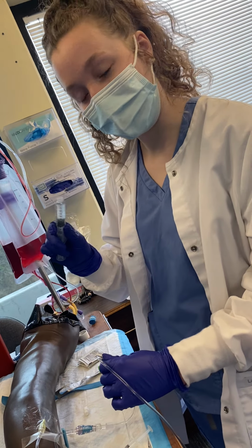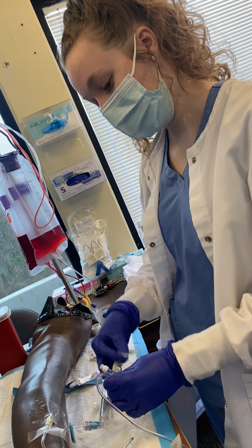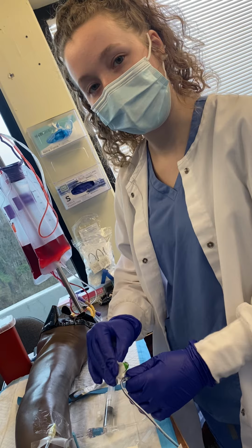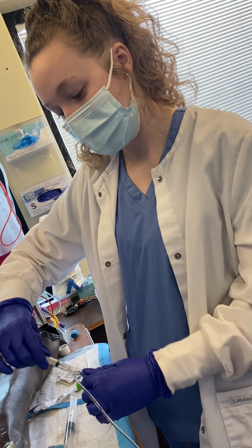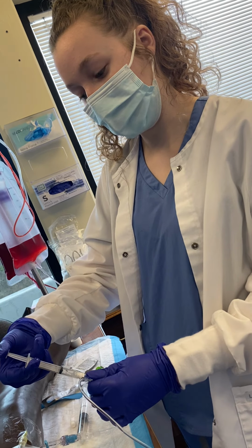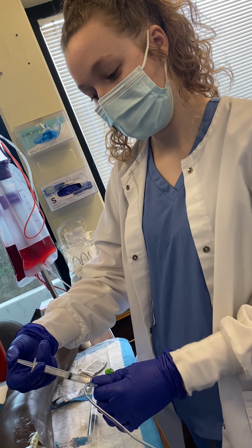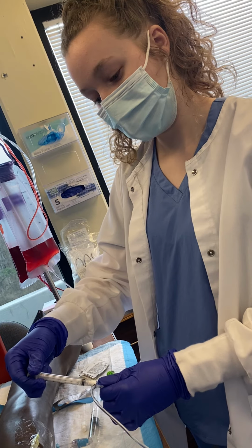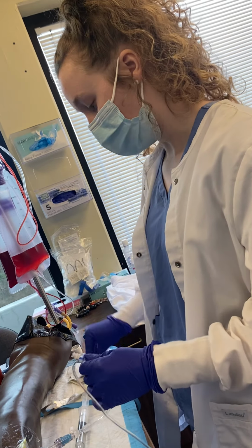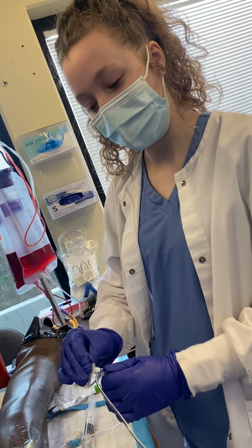Once I have my IV flush, I'm going to take another swab and just wipe off the port again. And then I'm going to take my medication. I'm going to push that slowly, or at the rate that it is recommended to be pushed. Okay. And then I'm going to take another alcohol swab and wipe that off again.